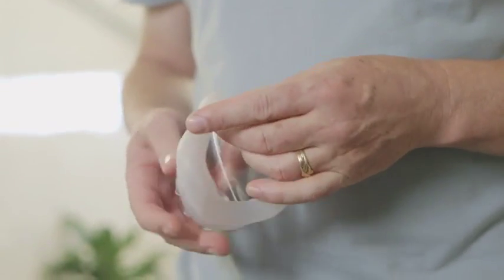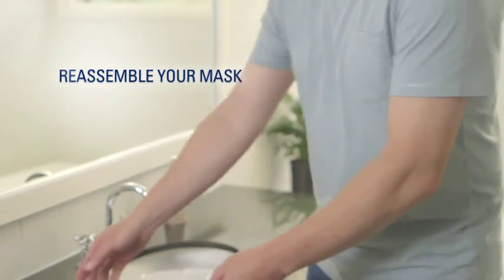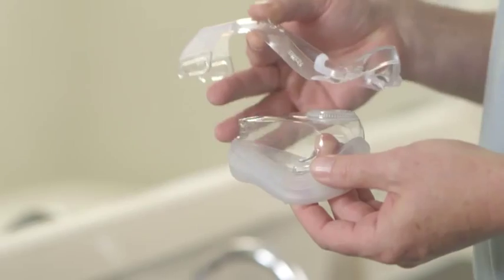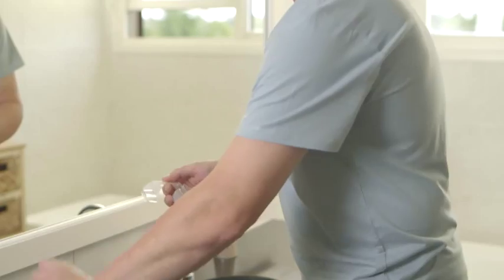Look for signs of wear, such as tears or cracks, and replace any worn parts before you put your mask back together again. Put the cushion inside the mask frame, and then gently squeeze it into place, until it clicks into position at the top and in both lower corners.